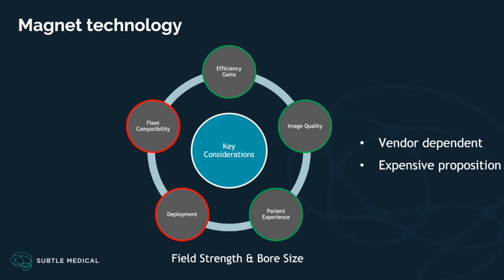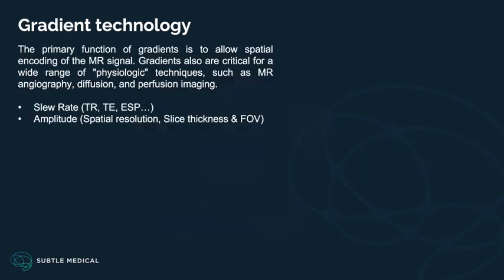So in short, upgrading a magnet technology can be a pretty expensive proposition. Let's go look at the gradient technology.